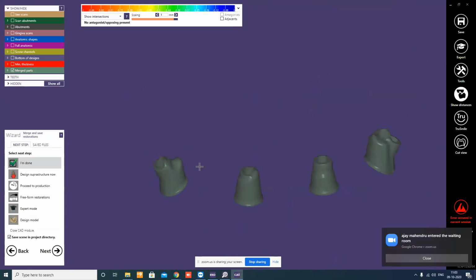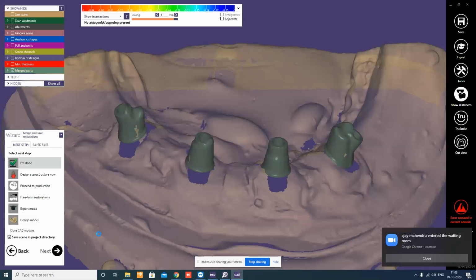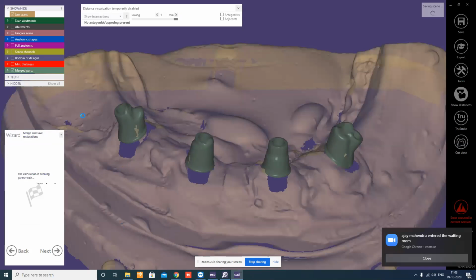This is a sacrosanct area, unfortunately. So this will not allow. At the moment when the abutments are milled, we can just trim it down. But if we trim it down, maybe the screw head could be seen and may not be very preferred kind of thing. So this is about customized abutments.